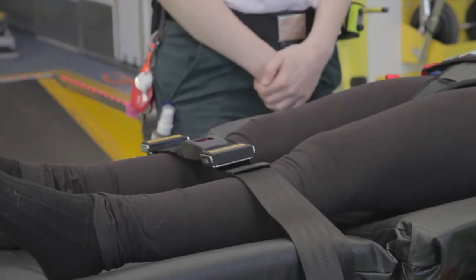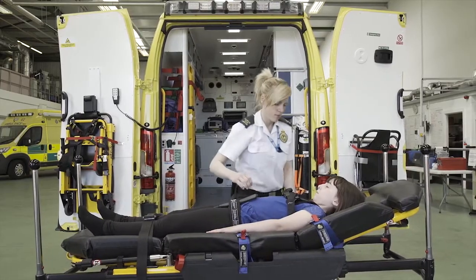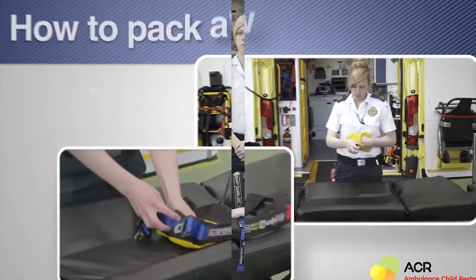Finally, tighten the four blue harness straps on the stretcher. Pull each strap down to tighten. The child is now secure.